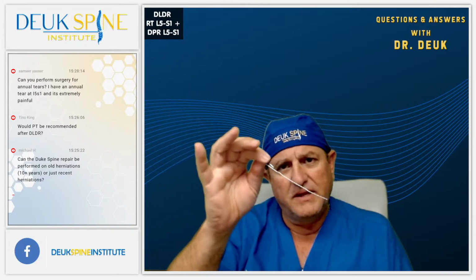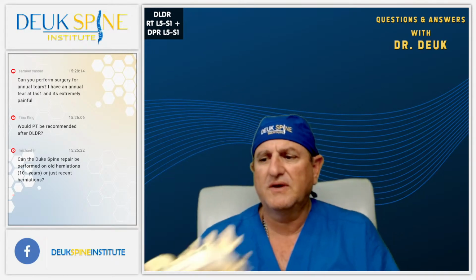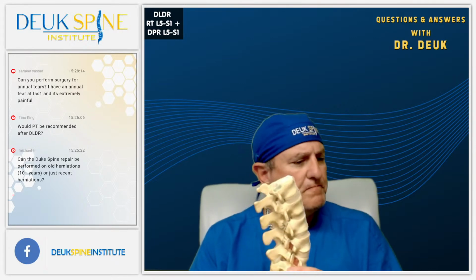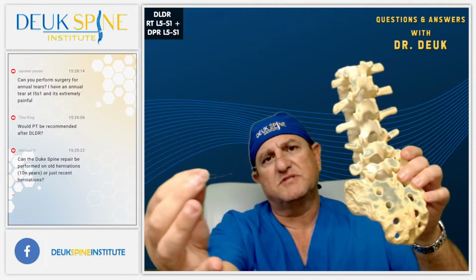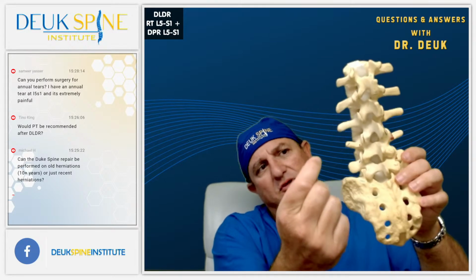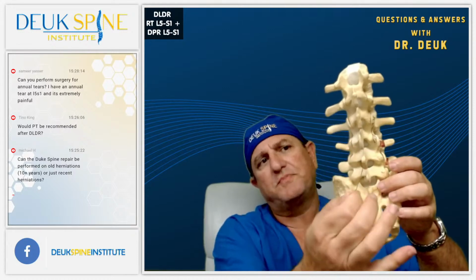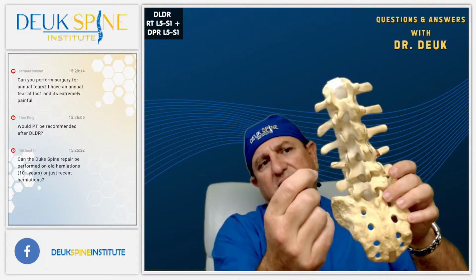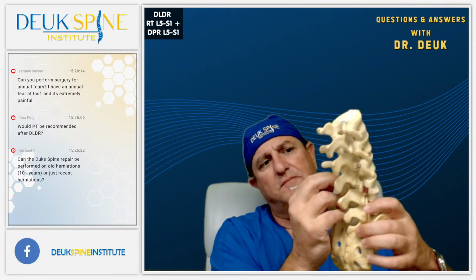Once I get the needle in and I'm in the disc inside the herniation, just so you understand what am I doing there. Anyway, if this is the middle, I'm coming from the side, and I'm going through a hole that's naturally already there, right there. The herniation is right there, okay? So rather than coming through your spine and taking bones and ligaments and muscles out, we come around the side, right there, and we get straight into the herniation, okay? See that?